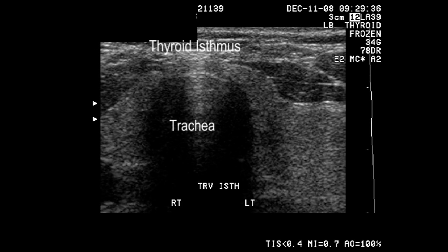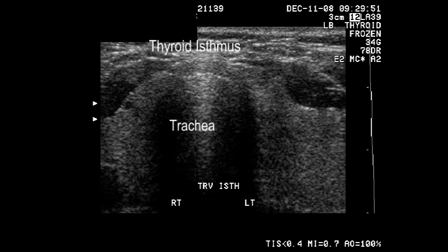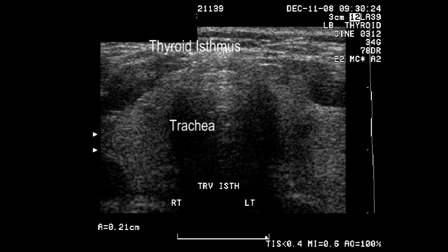This and the next few images are very impressive. They show the trachea very well and the small, thin thyroid isthmus which overlies the trachea.